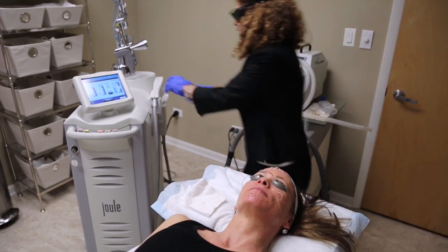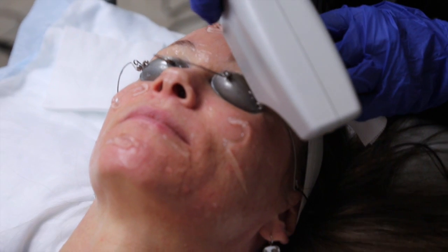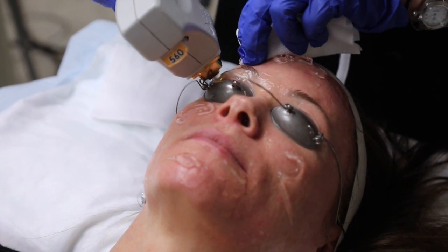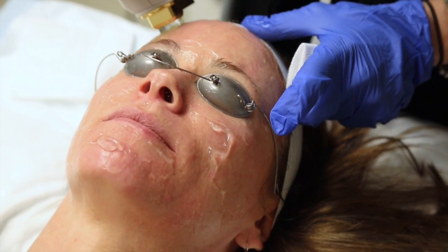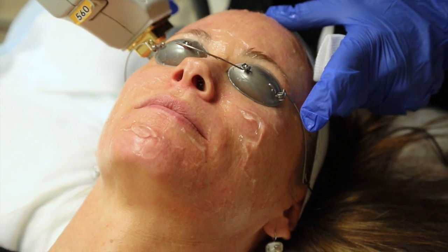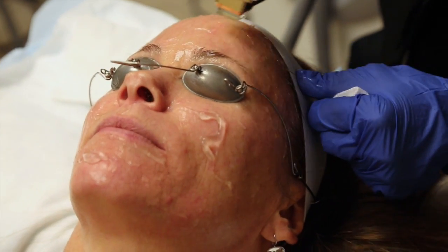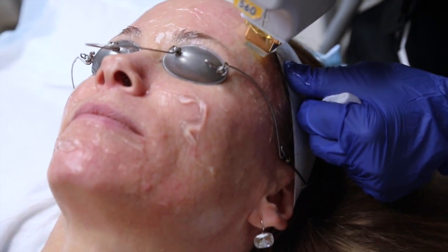Okay, so now I've changed out my filter to a filter that looks for red more than brown. Patients often ask the question, I can still see that bright light, doctor, are you harming my eyes? And the answer is no. The light is quite bright, and even I have special glasses doing the procedure that actually blink every time the light is flashed. That's how bright it is. But I would have to pry open the eyes and shine it right into the eye, and I would still only damage the cornea. But it is quite bright, and a lot of times people will jump as a result.